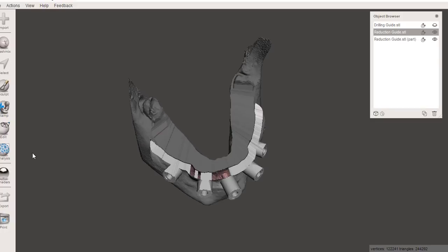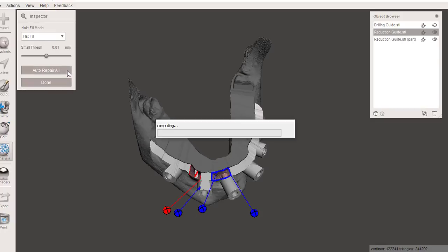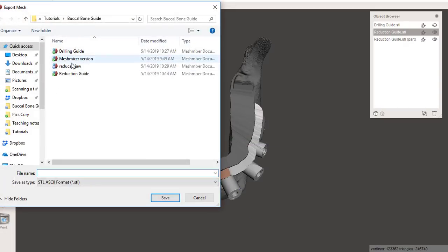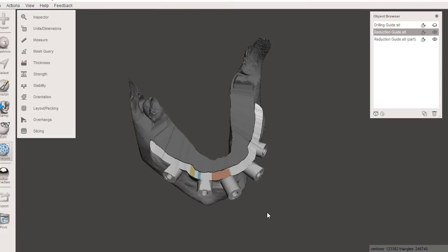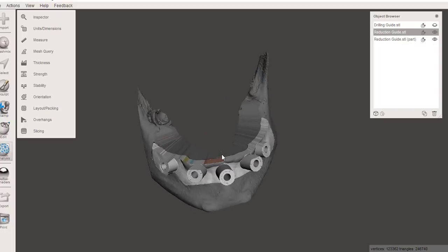And now let's repair the reduction guide: Analysis, Inspector. This we can just repair all of those. Done, export it, and write over your reduction guide. So that's the end of the process, and now you can see this is what's going to happen in surgery.